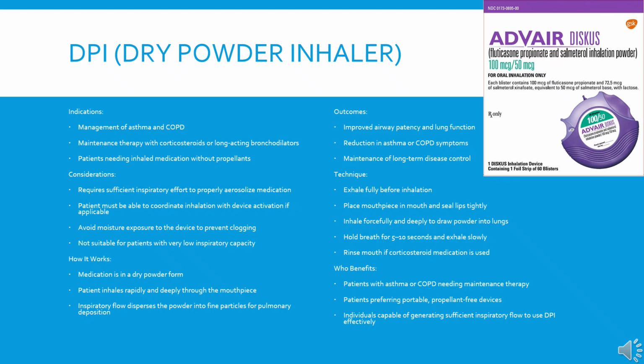How it works: medication is in a dry powder form, and then the patient inhales rapidly and deeply through the mouthpiece. Inspiratory flow disperses the powder into fine particles for pulmonary deposition. The outcomes: improved airway patency and lung function.